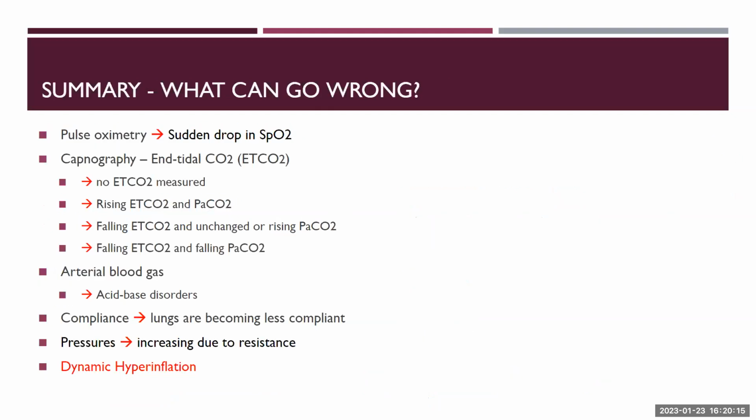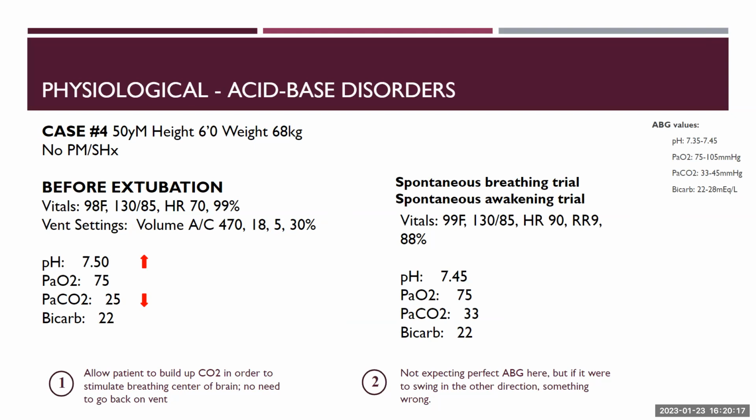So Minju, is it all of the points that you partly remembered, or was there anything else? Yeah, and I think the attending just one of our specific guidelines for the North Shore, because there are some numbers, but one of them was definitely being awake, which I forgot. Very good. It is the most important. I feel like people forget that the patient should be awake to breathe.